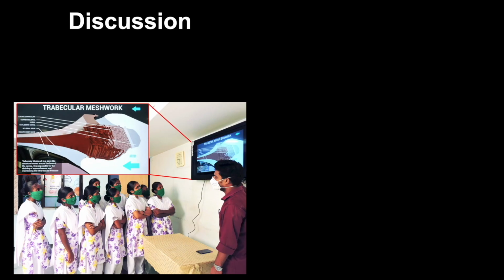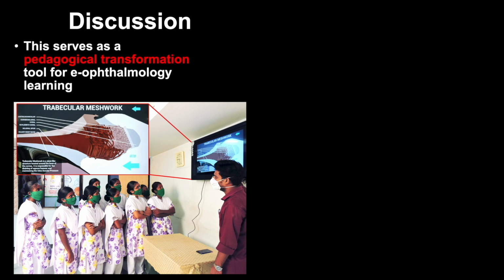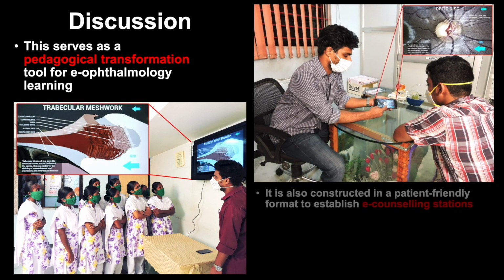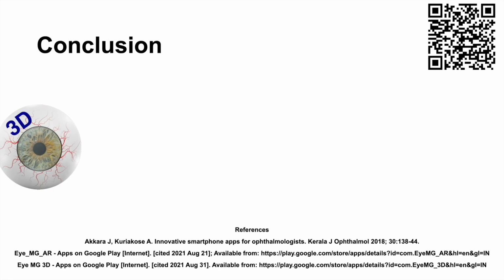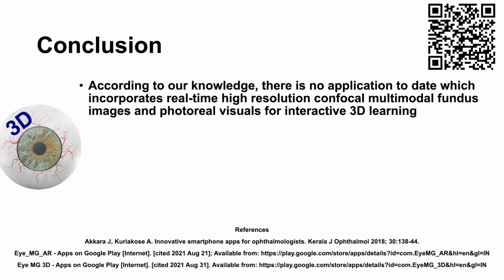Discussion. This app serves as a pedagogical transformation tool for e-ophthalmology learning. It is also constructed in a patient-friendly format to establish e-counseling stations. Procedures ranging from a simple YAG-PI or anti-VEGF injection to a complex trabeculectomy or retina surgery can be counseled with this app. To conclude, according to our knowledge, there is no application to date which incorporates real-time, high-resolution, true-color confocal, multimodal fundus images and photoreal visuals for interactive 3D learning.